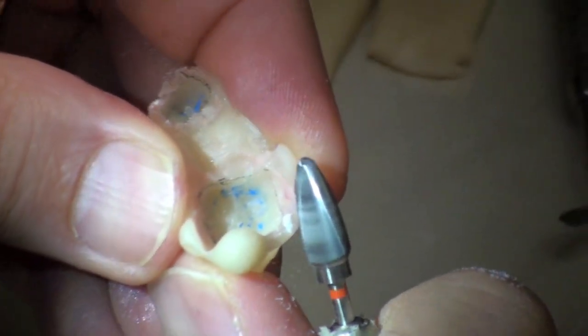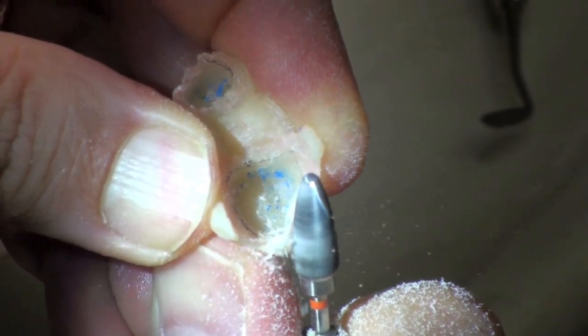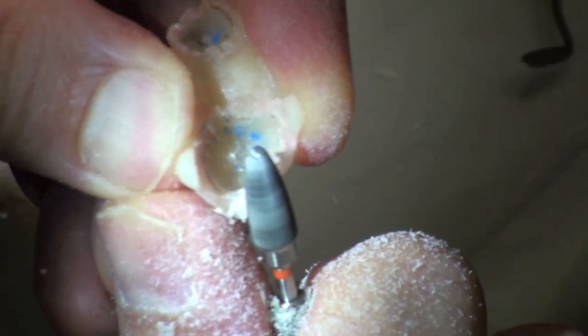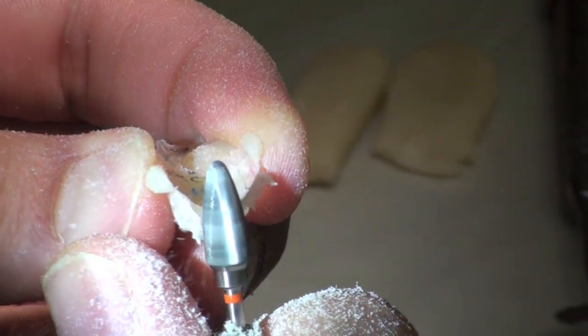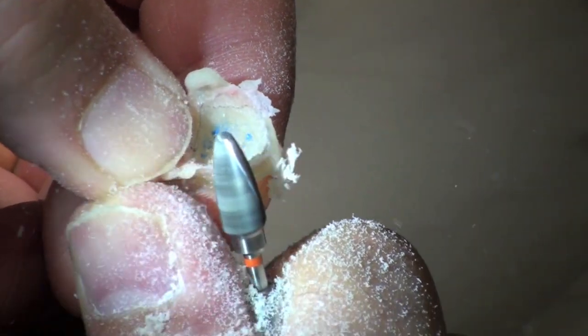Working from underneath — can you see that there, Gina? Can you see the underneath part? Working from underneath so I can see that line, I'm going to trim it back. Starting to see my margin better. Now holding it at an angle like this, but eventually I'm going to straighten that up a bit. Just working my way around.